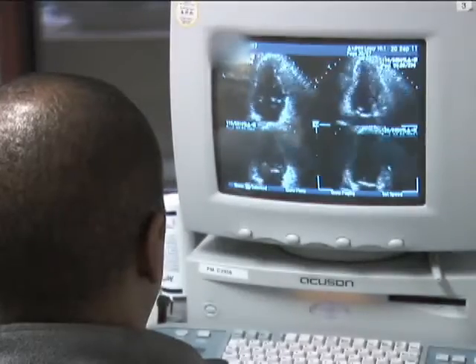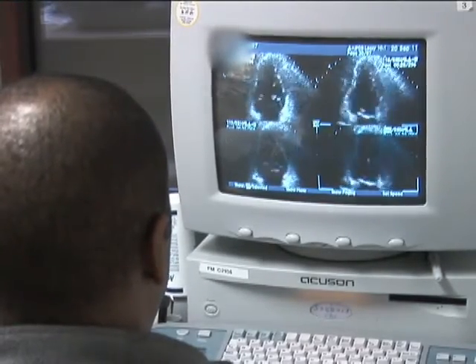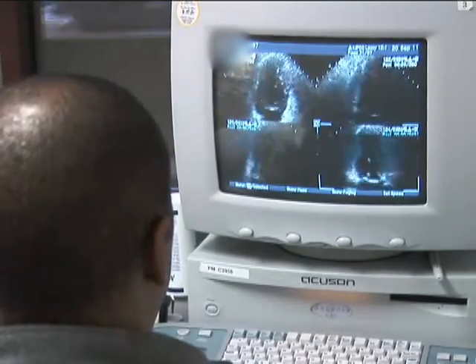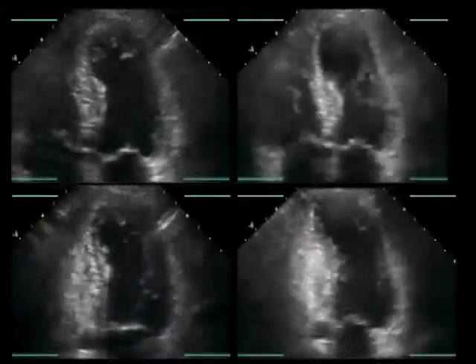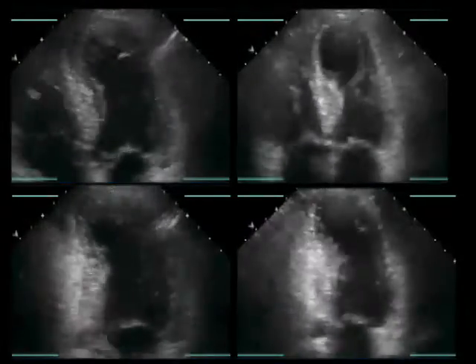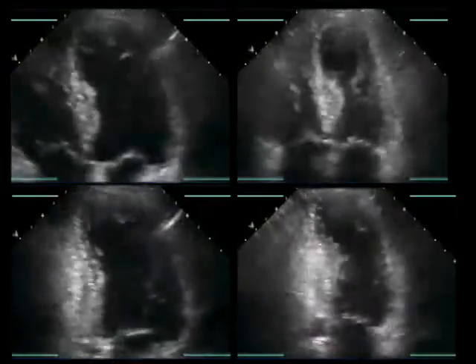The sonographer reviews digital loops from each view. The images that best show left ventricular endocardial motion are saved for comparison. Digital frame grabbers and split-screen displays allow side-by-side comparison of rest and stress images to facilitate identification of regional wall motion abnormalities. Digital frames are looped continuously for analysis.